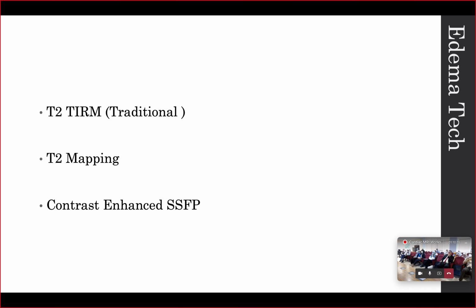Edema, which is the area at risk, is very important to measure. There are many techniques to measure the edema, but the traditional ones are the turbo inversion, T2 mapping, or the contrast enhanced SSFP, the steady state short axis cines after giving the contrast. But so far the turbo inversion recovery is the gold standard of measuring edema.